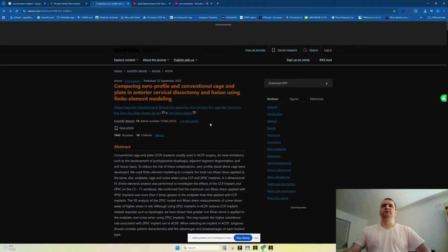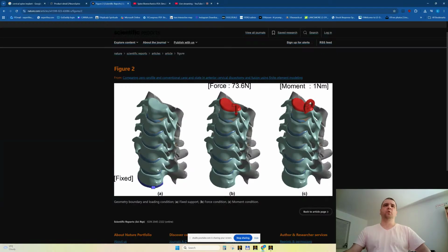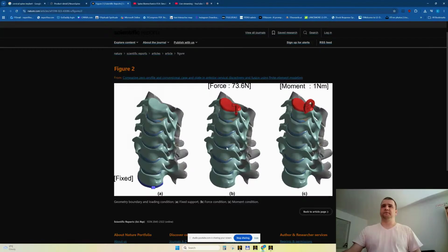So let me show you, at least let's take a look here. Also, we have the boundary conditions here, yes? This is fixed. Here is a portion, it's almost the entire cervical part of the spine. We know we have 7 vertebrae, including the atlas and axis or whatever it's called. No. And we're going to apply compression force and the moment. And we will investigate the stress in the mechanical parts, also in the bone and in the cartilages or the discs, let's say, contact pressure and whatever we can extract from this FEA.